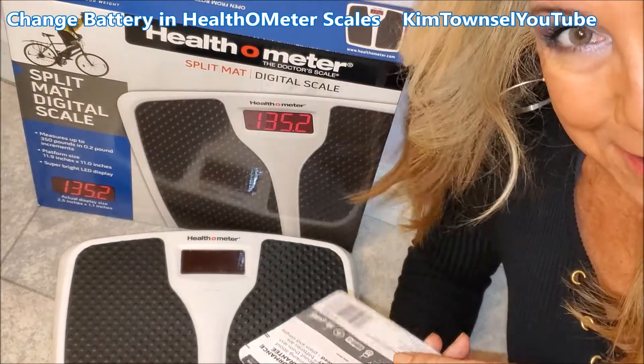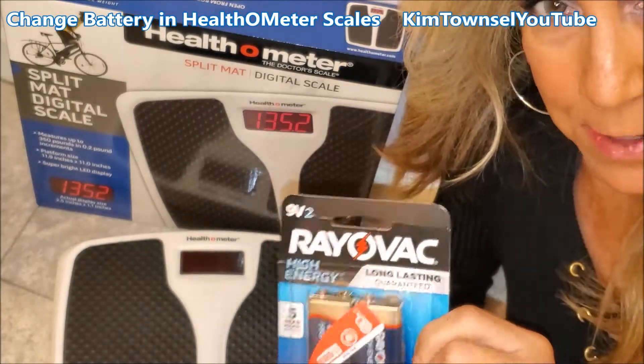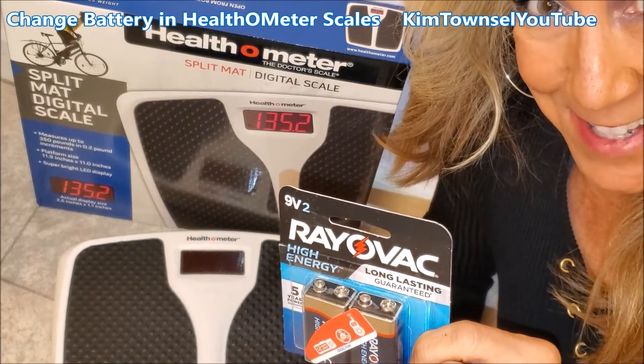Kim Tassel here. I did a review about my health-o-meter scales and one viewer asked how to replace the batteries, so I'm going to try to show you that in this video.